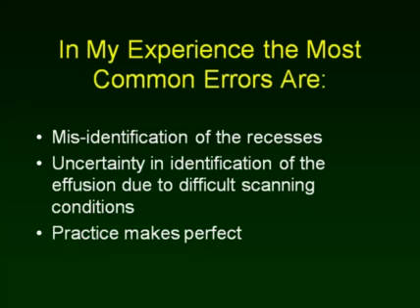In my experience in training a lot of house staff, neophyte scanners, the most common error in deciding where to place the needle is that the examiner becomes convinced that the hepato or spleno recess is the diaphragm, and that the liver or spleen, which are above that recess, are echo-dense effusions.